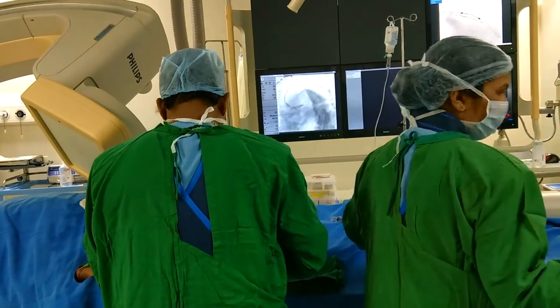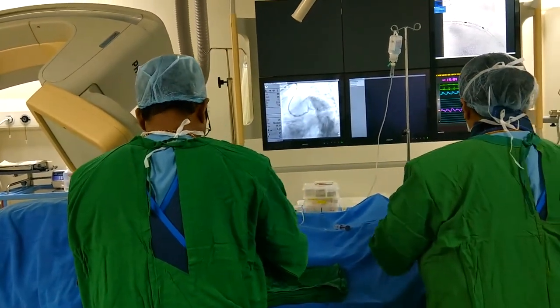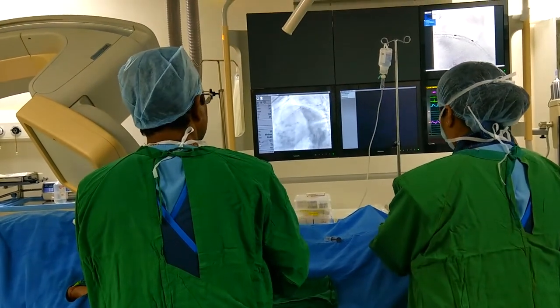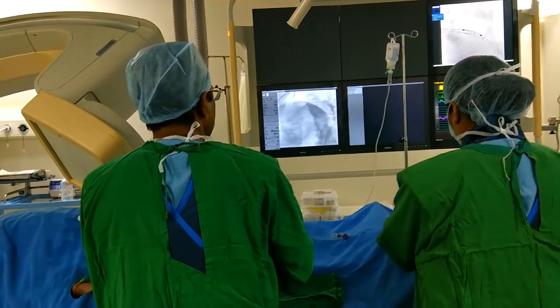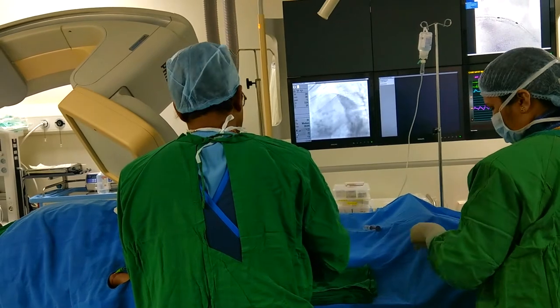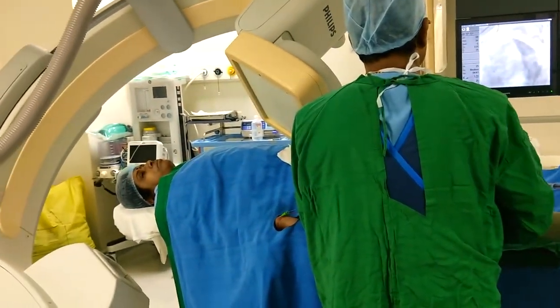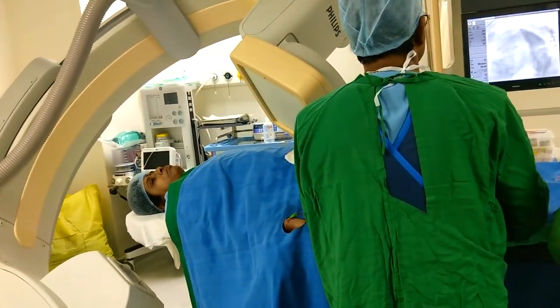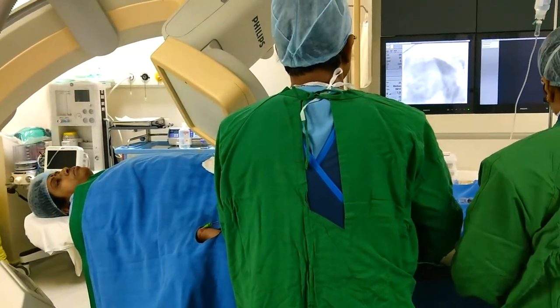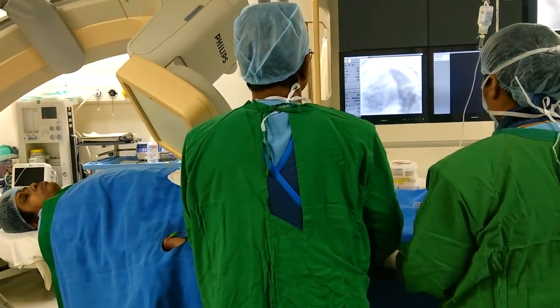Sometimes at the bifurcation level it helps decide between a two-stent or single-stent strategy. Most of the time, calcific plaques cannot be diagnosed by simple angiography — in those cases we use intravascular ultrasound.